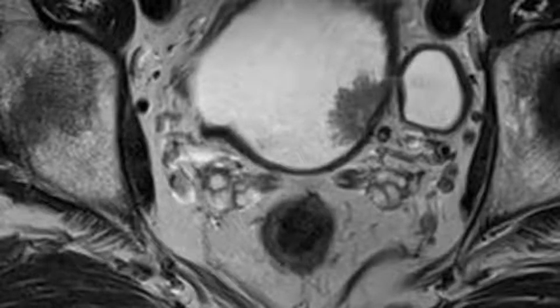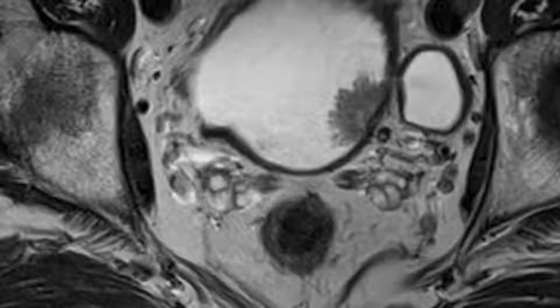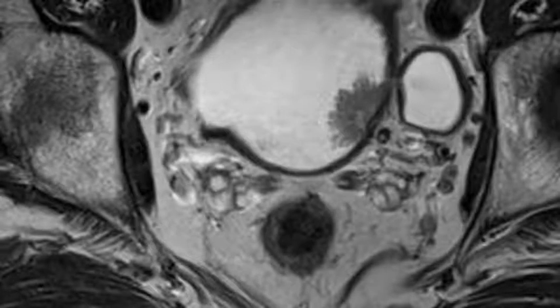The normal bladder wall does not enhance avidly on the early gadolinium enhanced image, which becomes important in tumor imaging. In the early phase, 20 seconds after contrast material injection, bladder carcinoma tends to enhance more than the surrounding bladder wall.